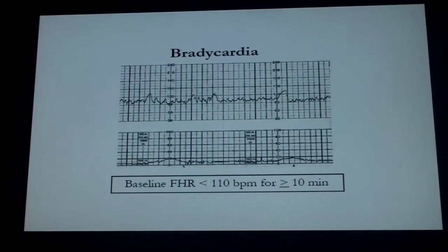Now we're going to talk about bradycardia. Bradycardia, by definition, is fetal heart rate less than 110 beats per minute for greater than or equal to 10 minutes. And we know that in practice, we see babies on MAG and other medications that will run low baselines.